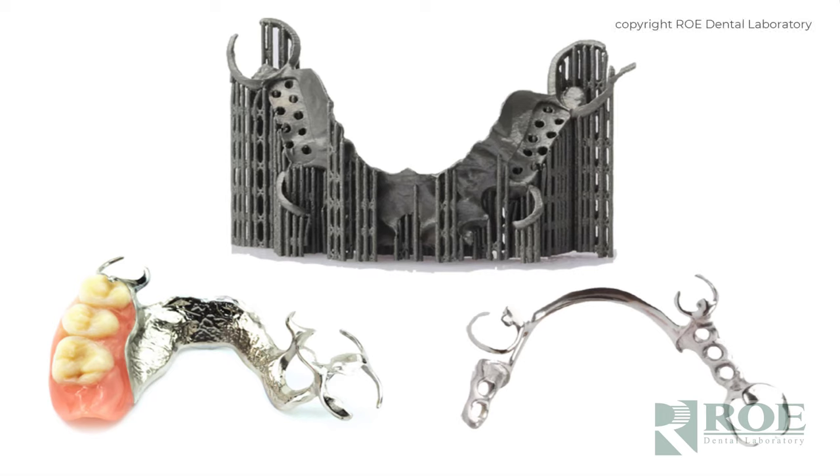This laboratory technical update will revolve around partial dentures. Partial dentures have changed dramatically in the past 15 years, but especially in the last couple of years with what's called selective laser melting — how we make these partial frames.